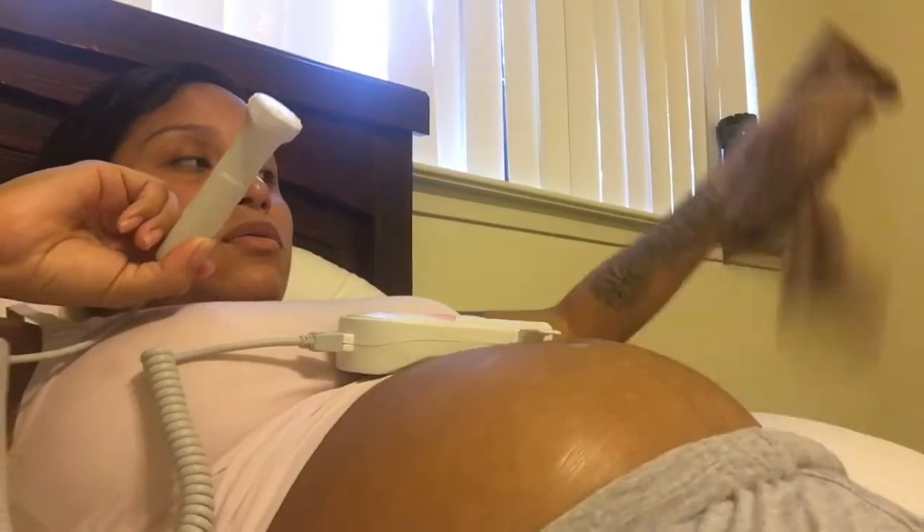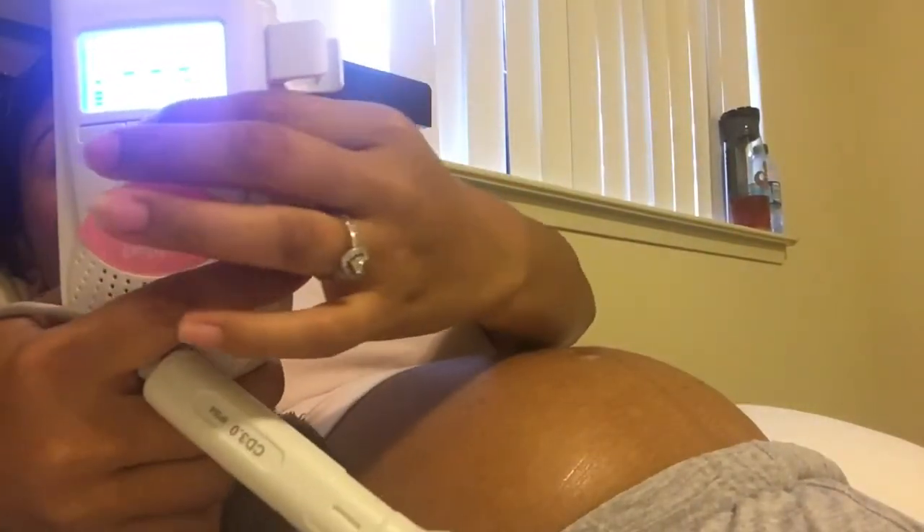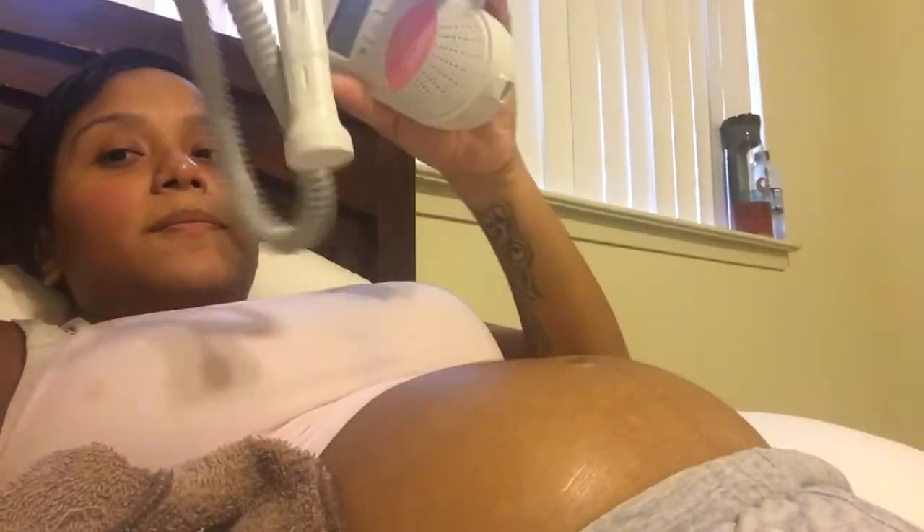I usually clean my belly off and grab a little rag to clean my probe. Then turn it off right here — and that's it. I usually unplug it so it's in two parts and put it back in the box.